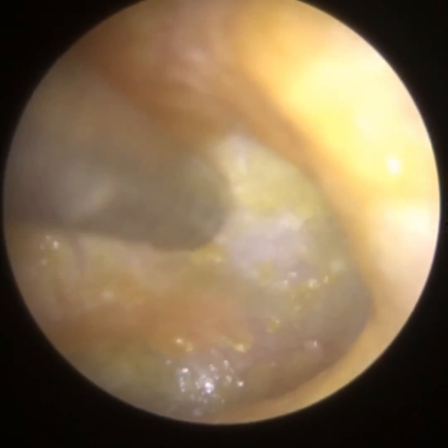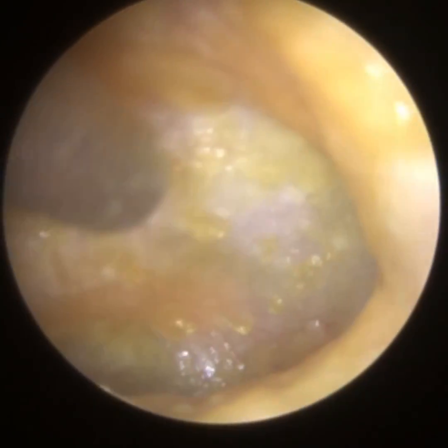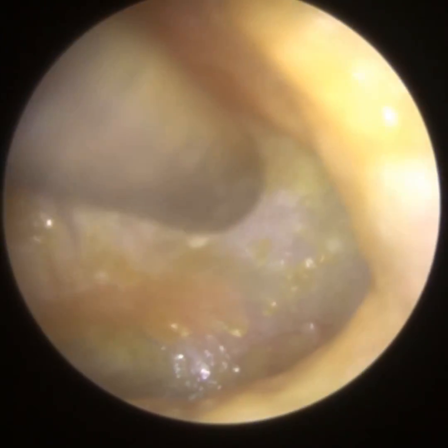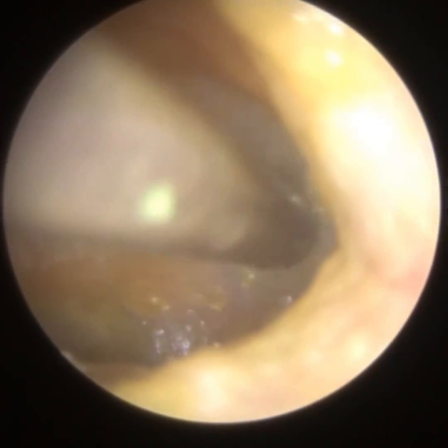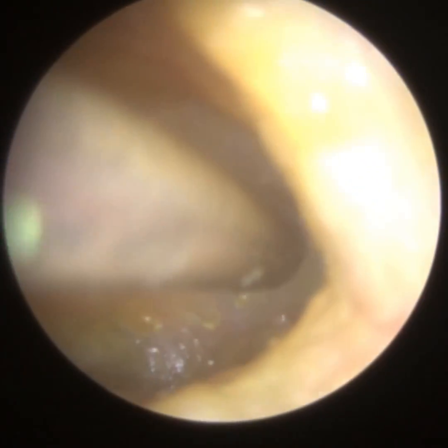Now, sorry I haven't talked much about the procedure because it is almost self-explanatory. All I'm doing is suctioning this debris off the eardrum using a fine gauge. If you stay tuned and watch at the end of the video, I'm going to replay the beginning of the ear so you can see the pre-procedure, and then you'll see the finished article. You can see the difference.